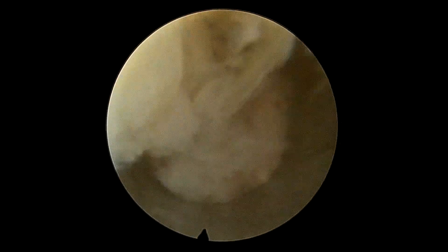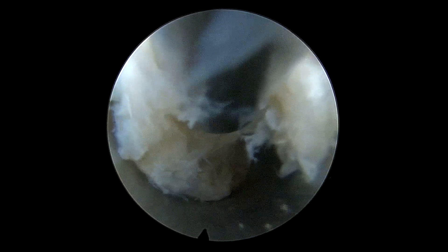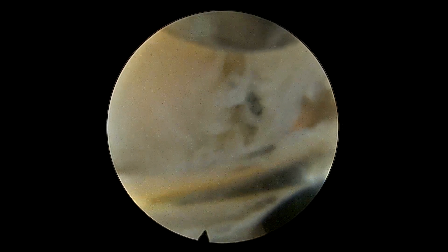Thereafter, there were some disc fragments which were herniating. We gradually teased them out, and as we were doing that, this large, big fragment of disc — perhaps the incriminating piece — was excised.